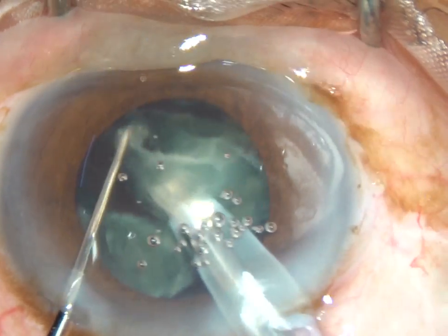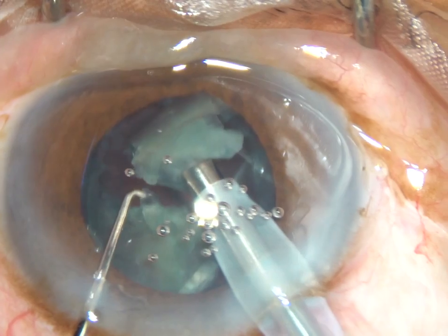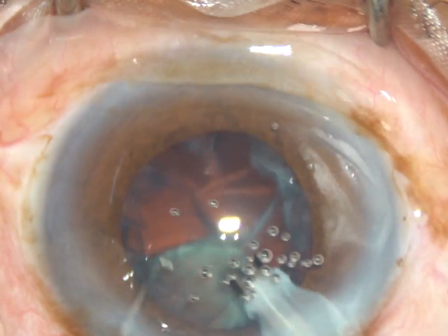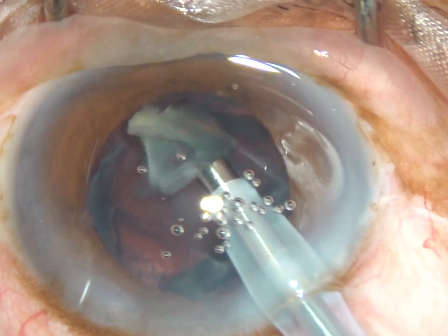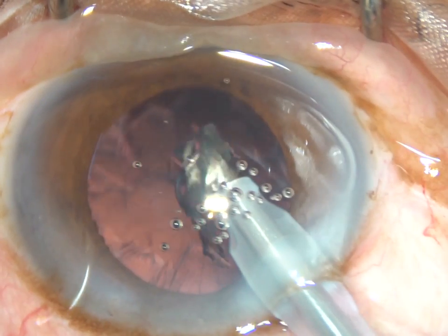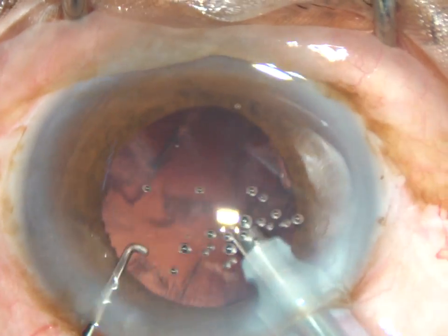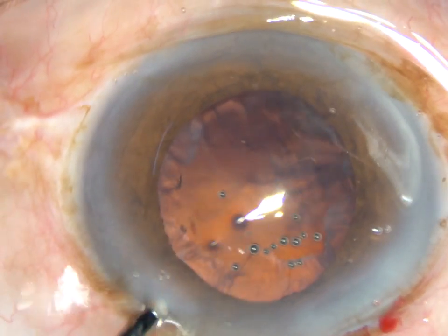In this machine there is longitudinal movement as well as transverse movement of the phaco needle. So it is a combination of longitudinal and torsional phaco. So the nucleus is smashed.